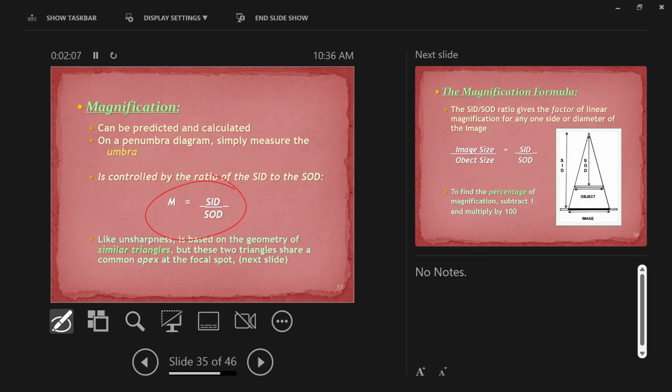So let's make something up. Let's say that one of the metacarpals in that hand that we x-rayed was 3 inches long. So let's erase some stuff on the board here. Metacarpal of hand equals, no, not 3 inches. Let's use centimeters. So how do I convert from 3 inches into centimeters? Multiply by 2.54. 3 times 2.54 is 7.6 and change. Ignore the change. 7.6 centimeters long. That's how long one of the metacarpals in that hand was, assuming, in centimeters.